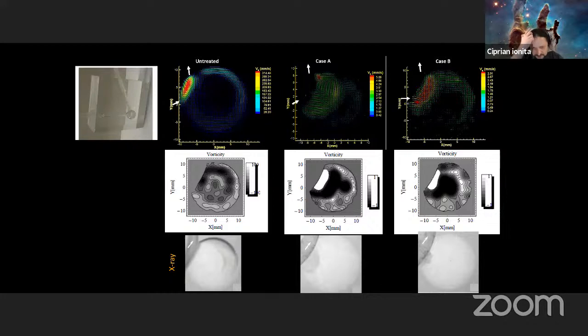So let's go over the physics of it. As I said, in the aneurysm, what we are trying to do is use the contrast to decide whether we're done or not. And in here, I'm just showing you some scientific experimental flow data that backs that up. So we took phantoms like this you see in here a long time ago. We've been at this for more than 20 years. I would say that the flow diverter concept also emerged partially in Buffalo in the early 2000s.